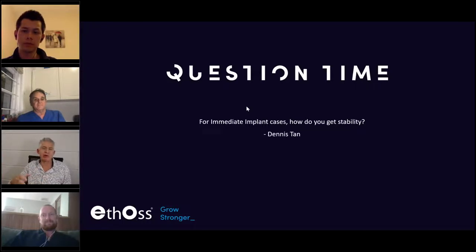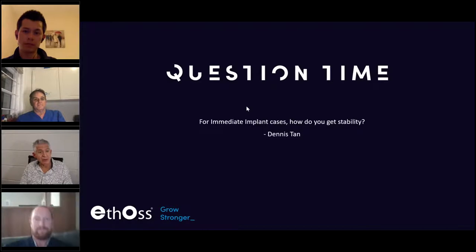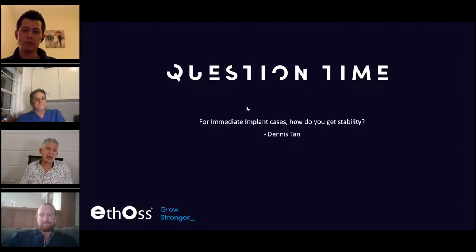So yes, you've got to combine various techniques: use a wider implant, underprepare, use osseodensification. Osseodensification is a very important tool that's helped us in the last few years to achieve better primary stability. So that's the only extra thing I can add to what Ludwig said. Osseodensification is something more and more people are using now, Versa osseodensification.